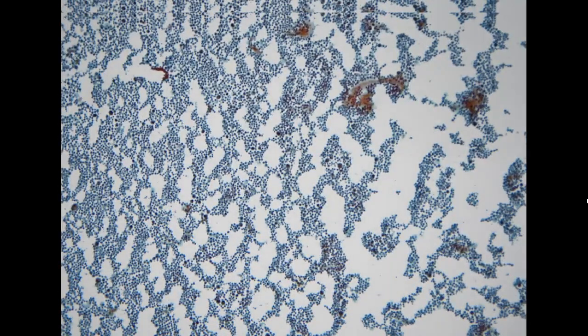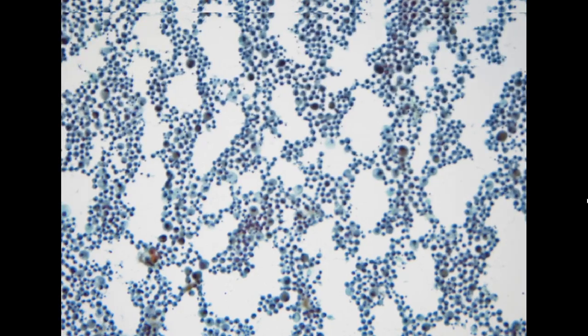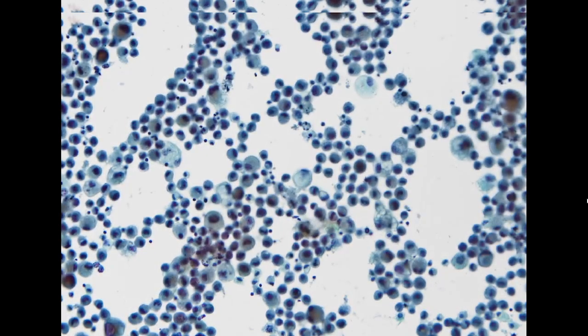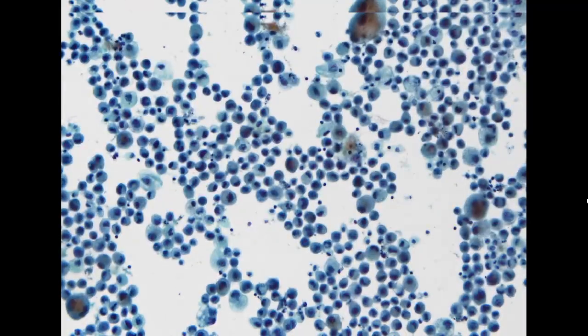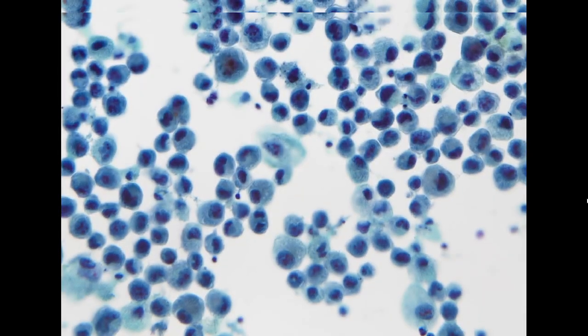The next specimen is also a pleural effusion specimen. The patient already had a history of lung adenocarcinoma, proven to be EGFR positive, and this is suspected to be a recurrence of disease. You can appreciate the cytomorphology is very different from what we just saw. The more well-differentiated adenocarcinoma will form clusters, but here we only see individual single cells. This is a sign suggesting it has already developed poor differentiation.